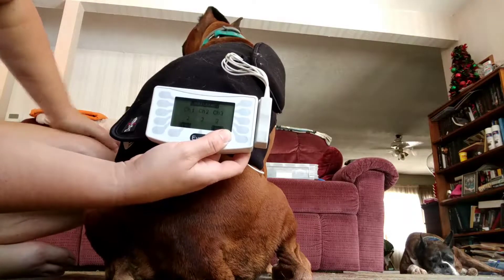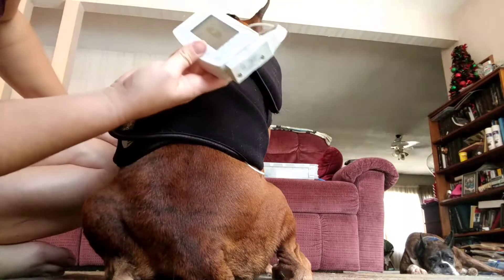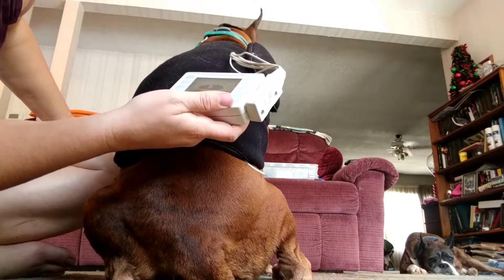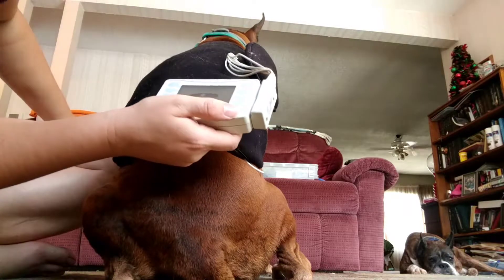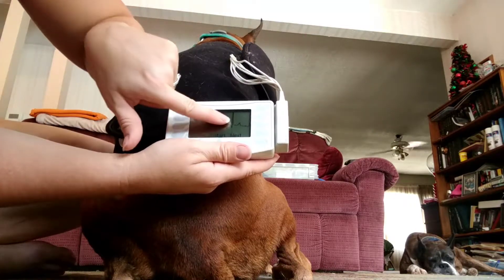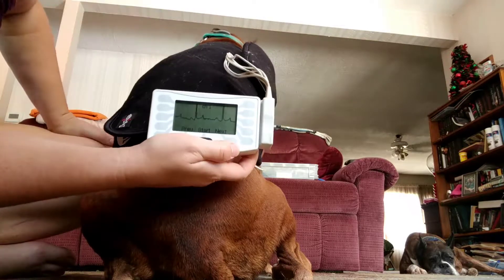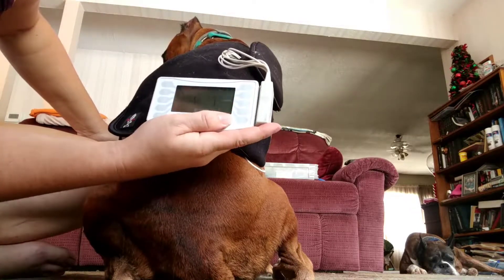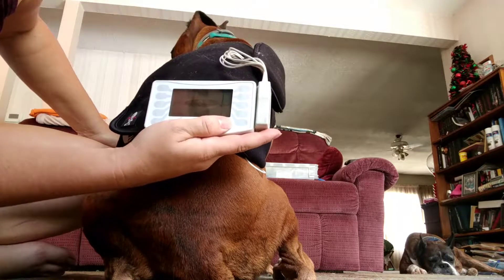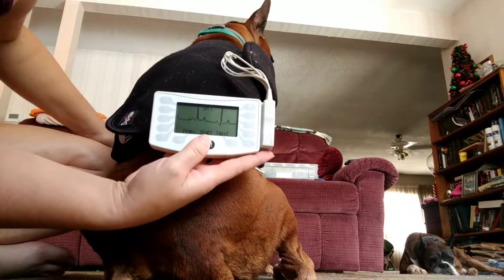You're going to see three numbers — this is the three-channel connection quality; five is the highest. I've got between two and three right now. It's going to show you channel one so you can actually see that it's working. If you just have a straight line and you're not getting the little rhythmic bumps, then you didn't hook something up right or one of your electrodes is bad. You want to make sure each channel is showing a signal.